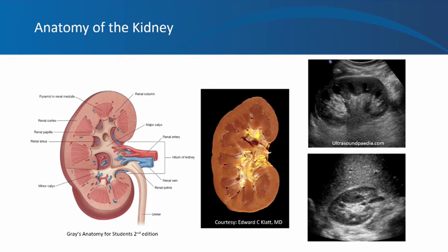Ureters are normally not visible in a healthy kidney unless they are distended due to urine backflow. In the transverse section, you can see the cortex, medullary pyramids, sinus fat, and a blood vessel — most likely a renal vein. This structure is not the ureter because it appears hypoechoic, meaning it contains fluid. A normal ureter is not visible unless distended, so this is most likely a vessel.